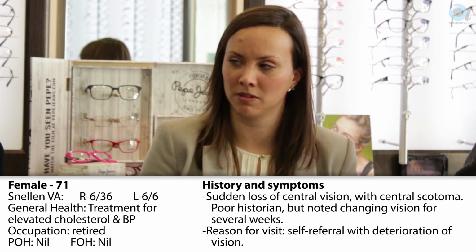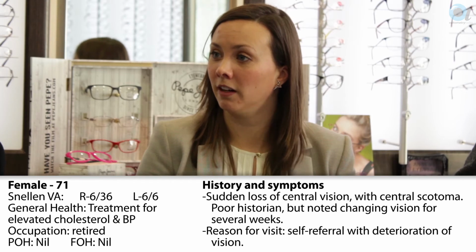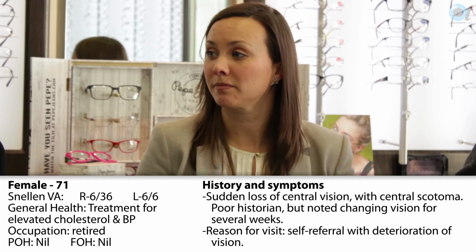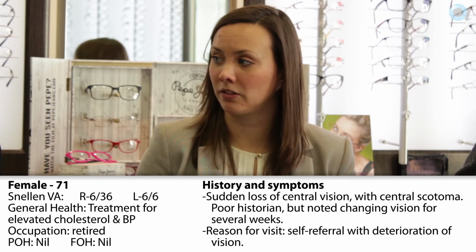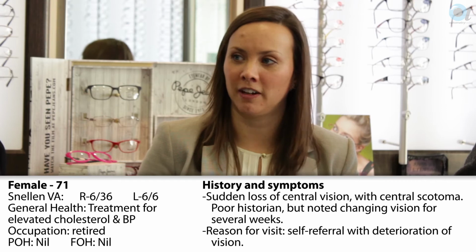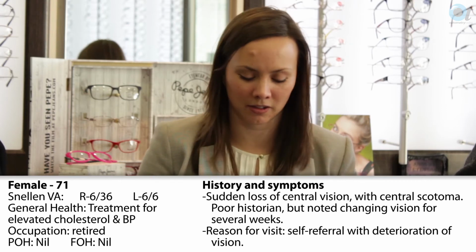We haven't got the OCT images of that left eye. It'd be useful to know if there's some traction going on there, or it might give us clues as to what happened in the right eye as well. Yeah. And so you'd want the OCT image, the other eye for sure? Yes. Even though she's got good acuity, it may look fine with an ophthalmoscope, but it'd be lovely to see what's going on there.